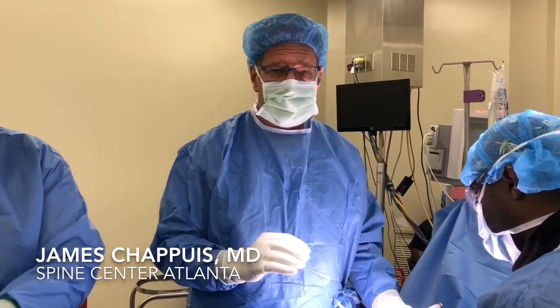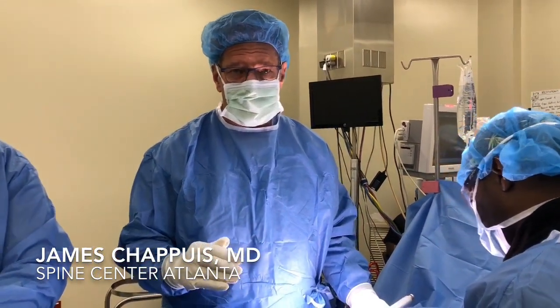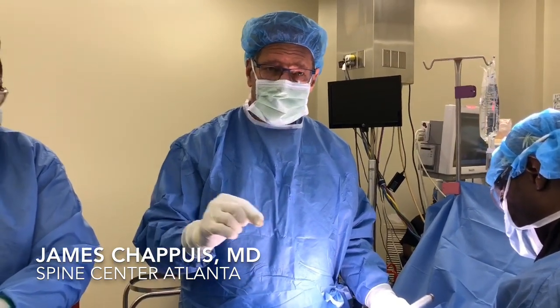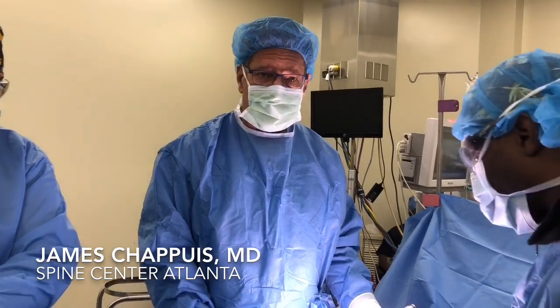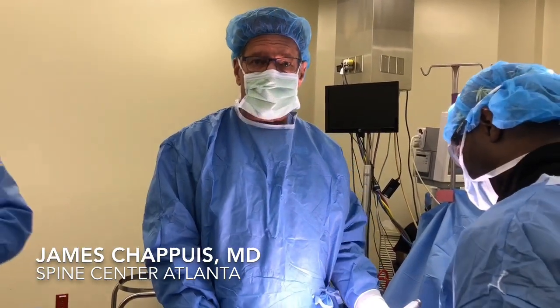Our task today is to remove the loose painful pedicle screws and open up the bony canal where the S1 nerve root rides. This is being done as an outpatient, and she'll go home later today.